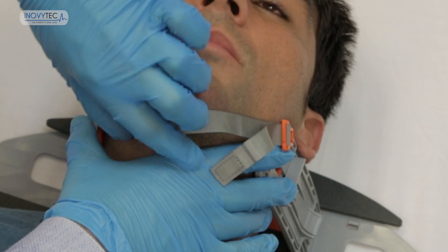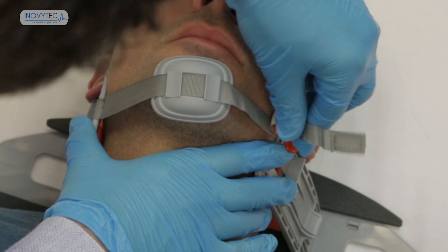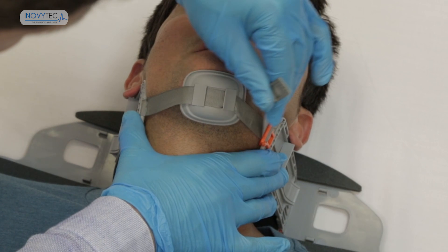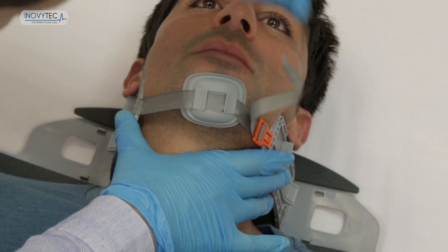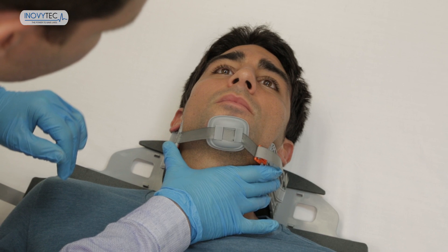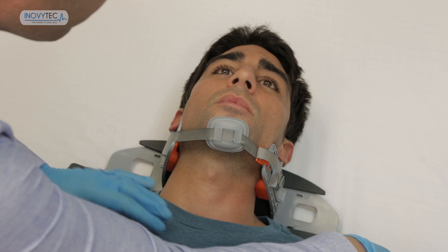Hold both arms in one hand while the other hand is used for attaching the hook to the left arm. Center the chin strap and fasten the airway system by pulling the chin strap. Do not let go of the arms until the airway system is firmly fastened. Phase 1 completed.